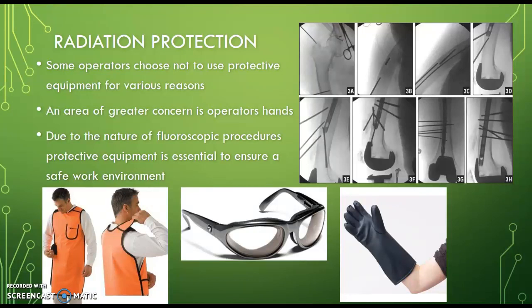So if you're having back pain, you're probably less likely to want to protect yourself, since the radiation isn't going to immediately affect you. And also, back pain caused 33% of respondents to miss work, caused primarily by long-time use of the heavy lead garments. So even though it can cause some minor health problems, it's better to protect yourself from the radiation, because over time that will accumulate and really negatively impact your health.